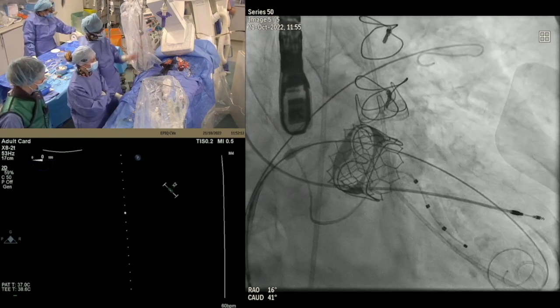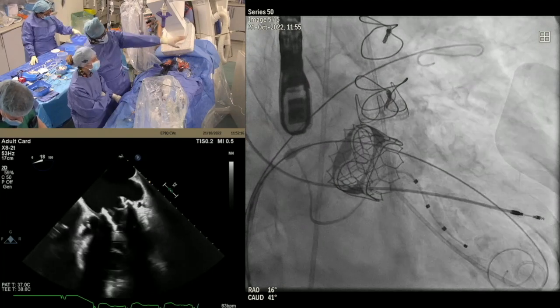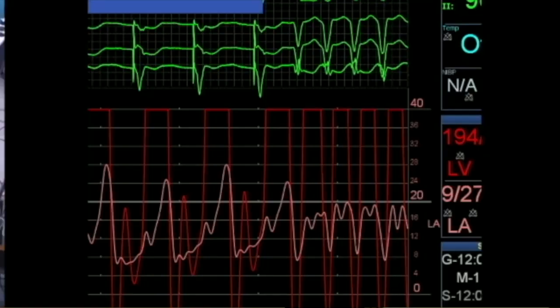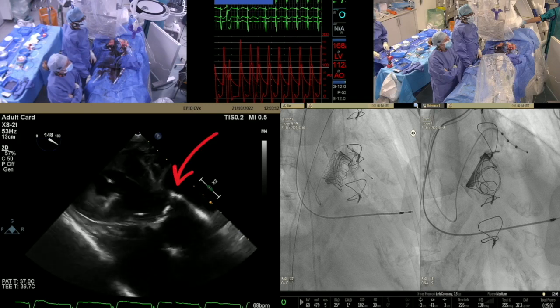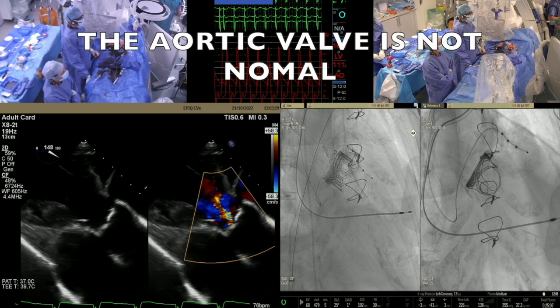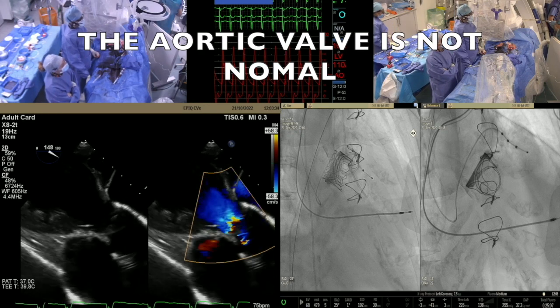The aortic valve, the LVOT, you would hope was fine, because most of the LVOT is clearly behind the plane. That's where the pigtail is, and that's where we've got the gradient. So the mean is 4. It was 9. Okay, that it doesn't look absolutely normal. I don't see a lot of turbulence in the left ventricular outflow tract, and so I think there's a lot of this which is just the valve.